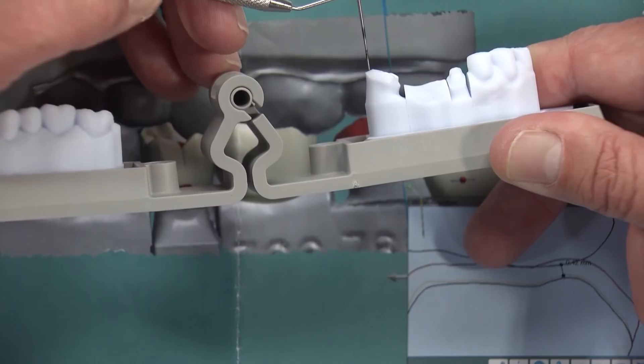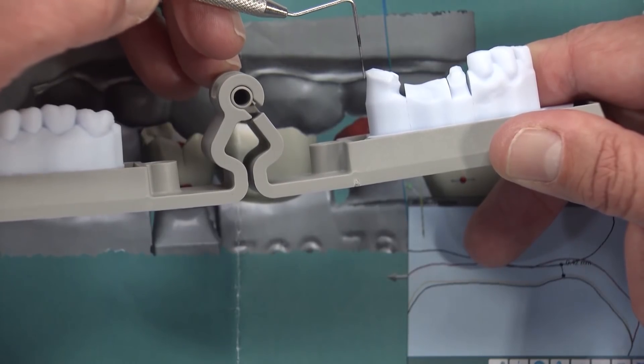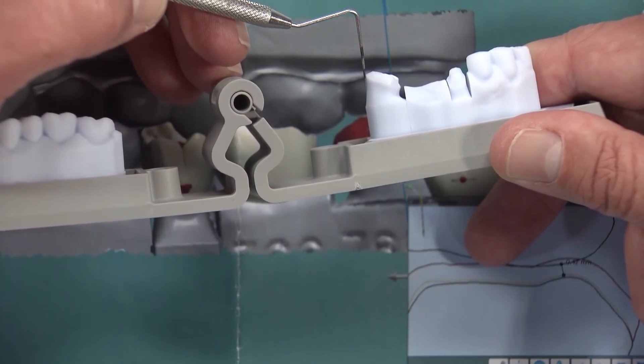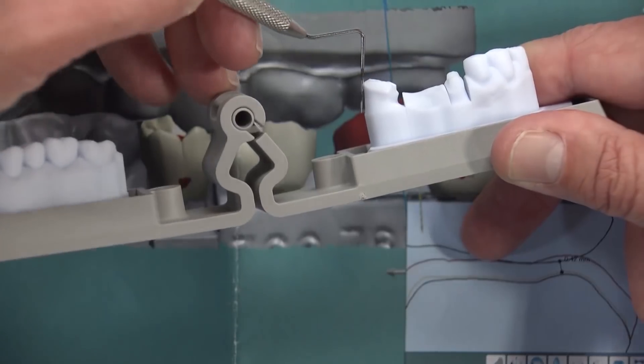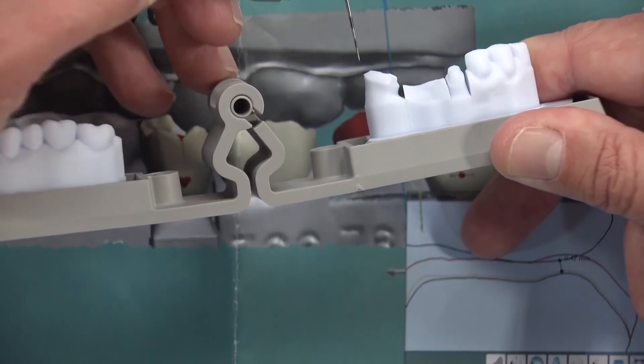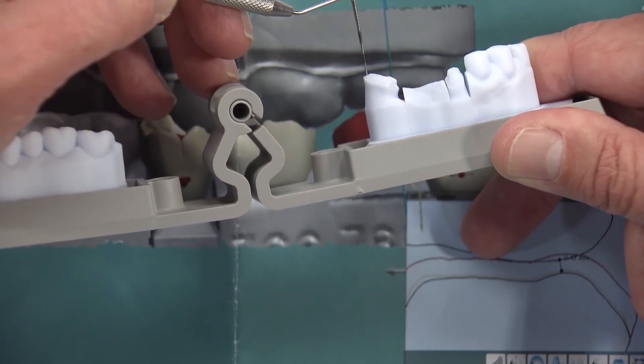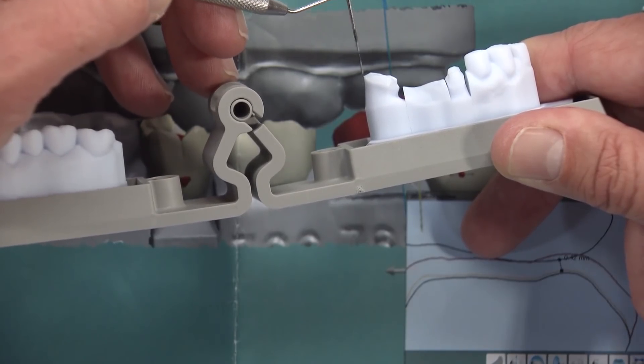In an ideal world, this tooth would probably have crown lengthening, where a periodontist or the doctor would go in and remove some tissue, drop the bone down so we can get a little more room. The farther the tip of the bur goes subgingivally, the more straight up and down we're going to be able to hold that bur and get a better wall. This is essentially a non-retentive surface here on the distal of this lower second molar.